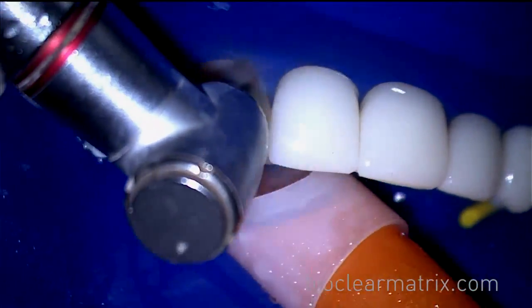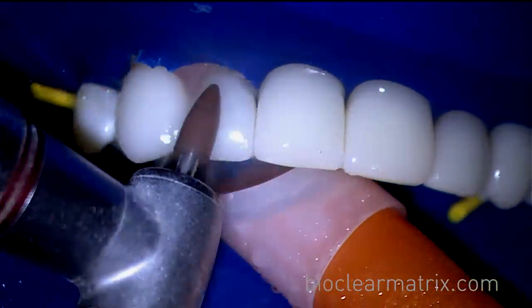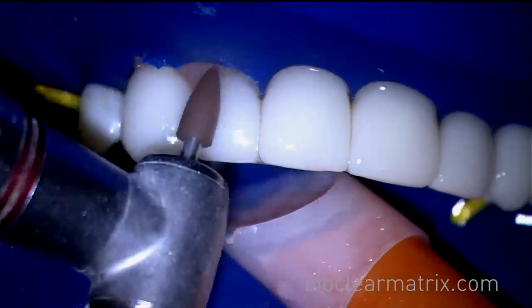Step 1: Use a Shofu brownie to marginate the composite. If you're using an electric handpiece, reduce the RPMs to 12,000.